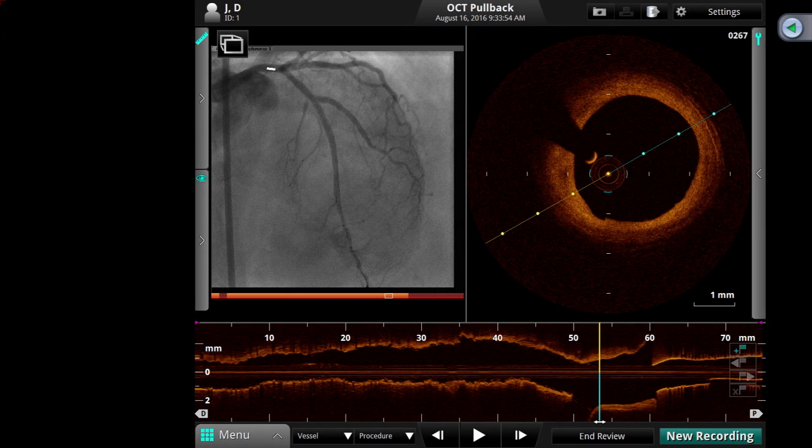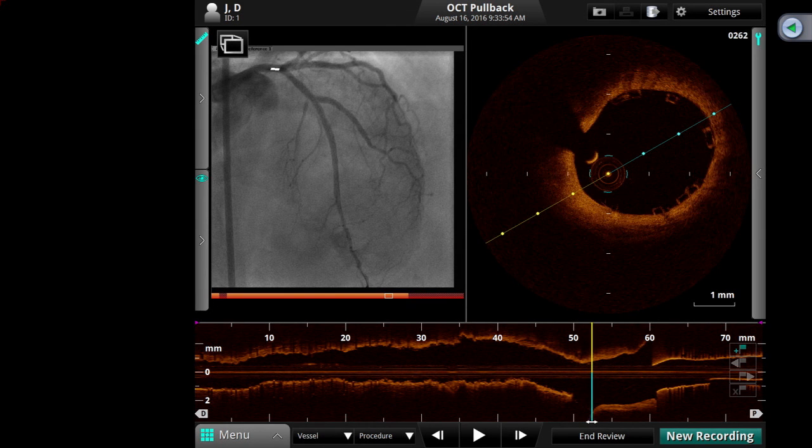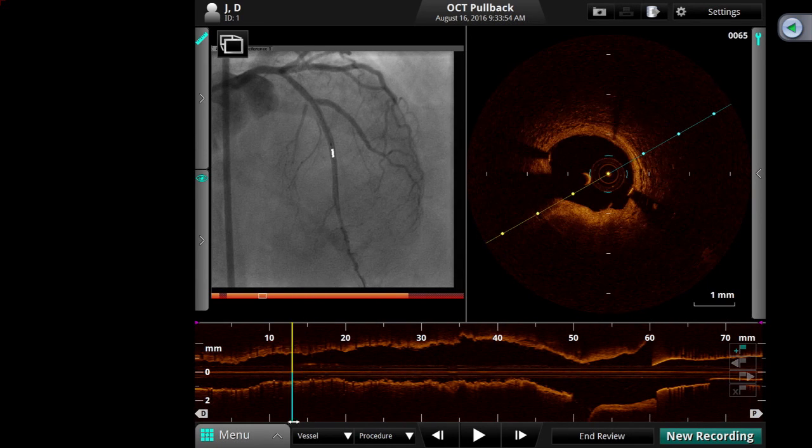Up to the ostium. What is this side branch? High lateral. Good. Yeah, came up to the ostium. Looks very good. Beautiful. I think we showed you at that point where the 10% residual was. It was not well opposed, but you don't have to go back and post dilate. Good. Go back to now.